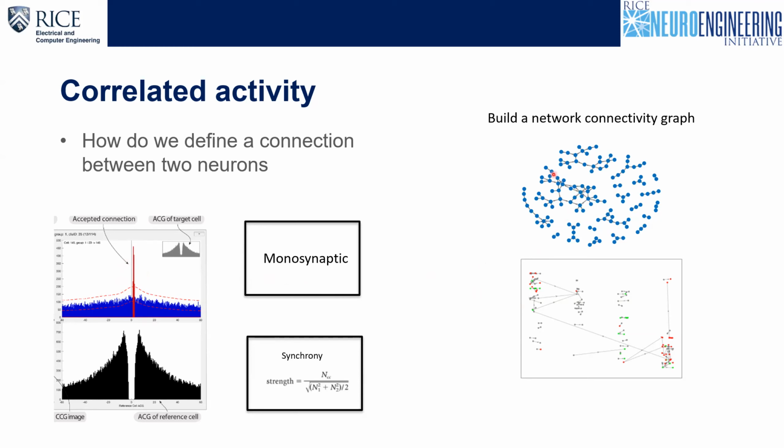So this is from our data where we actually found the connections. This is the same diagram, but more geometrically precise. These different vertical columns are the 4 different shanks that we have of the neural threads, right? And all of these circles are the neurons that we found, and we can see that there are a lot of connections within the same column, and very few connections across different columns.